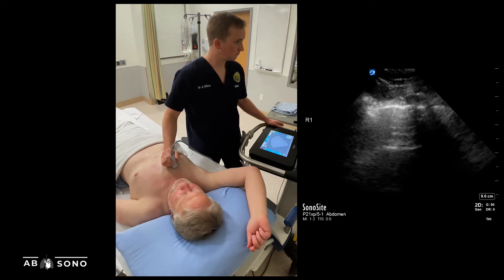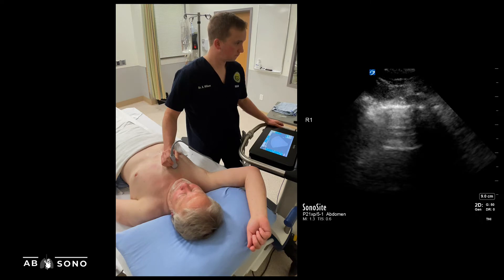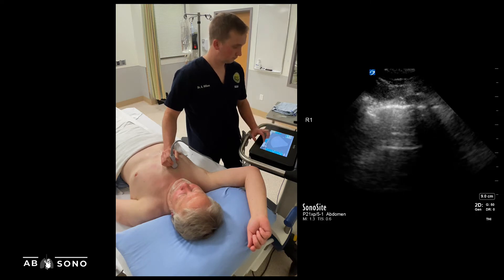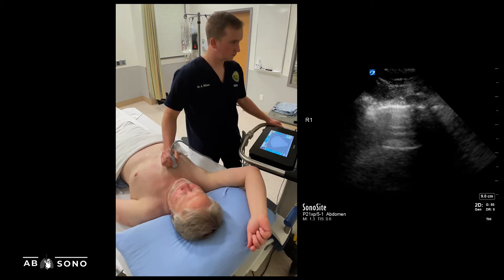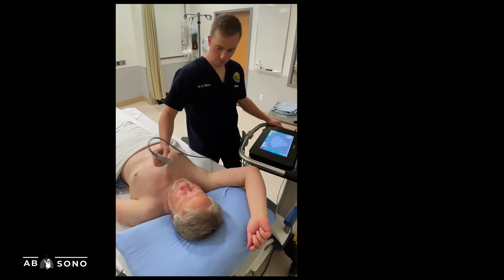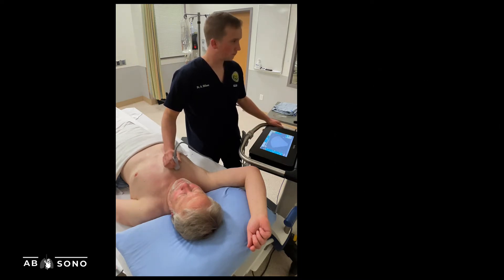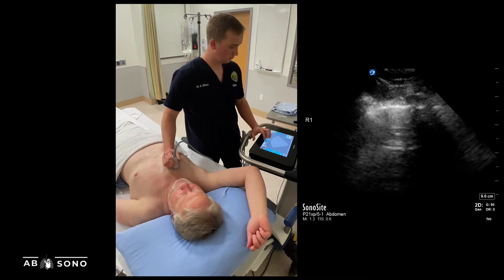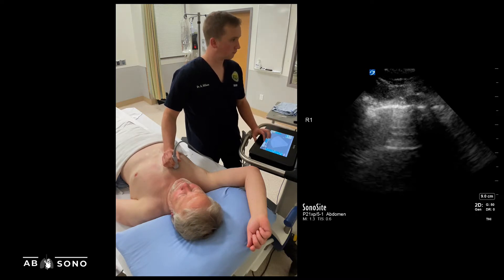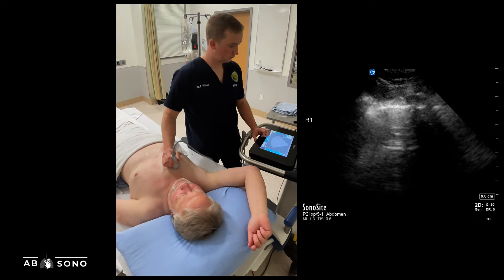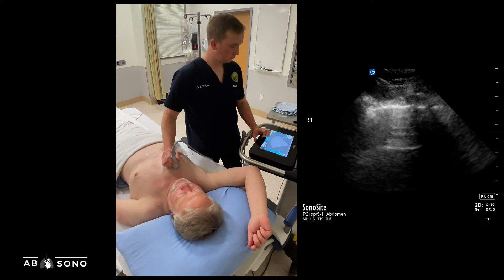Either the abdominal or lung presets are both acceptable exam types. While the lung preset will enhance A- and B-line artifacts, this can make imaging deeper structures like the pleural space more challenging. Therefore, we suggest the abdominal preset is selected, especially when imaging the costophrenic angle.